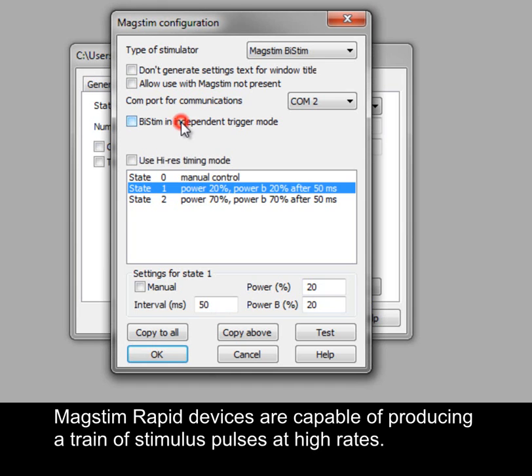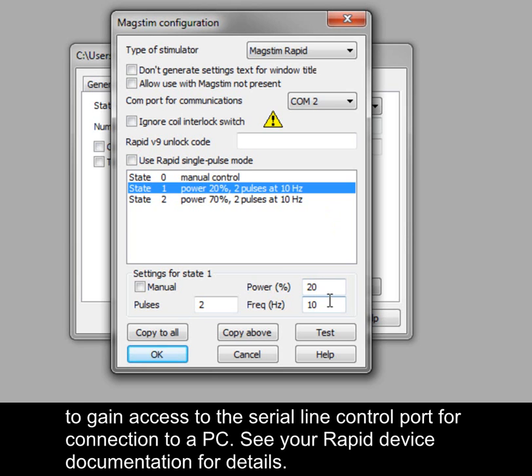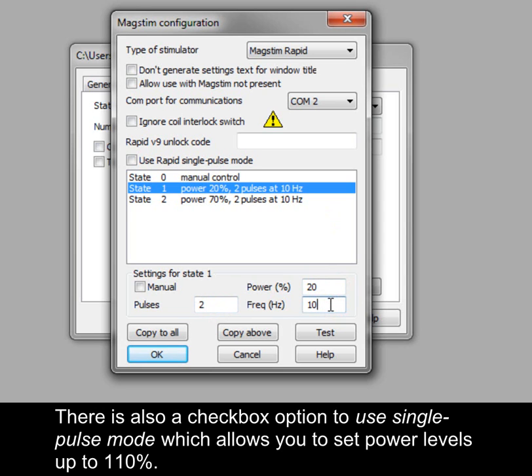MagStim Rapid devices are capable of producing a train of stimulus pulses at high rates. The Rapid may have a separate control system that has to be disconnected to gain access to the serial line control port for connection to a PC — see your Rapid device documentation for more details. You can set the intensity, number and frequency of pulses in the settings section of the configuration. There is also a checkbox option to use Single Pulse Mode, which allows you to set power levels up to 110%.